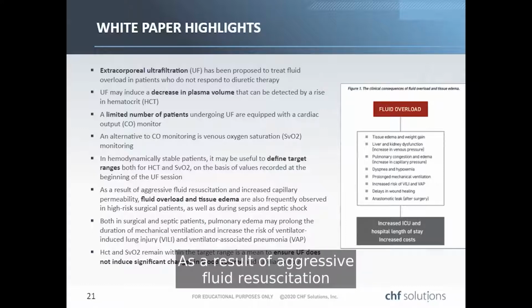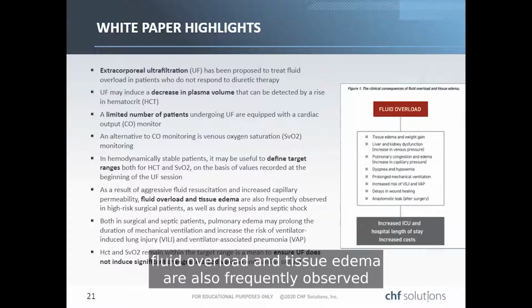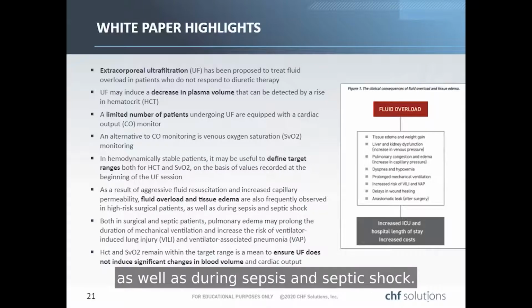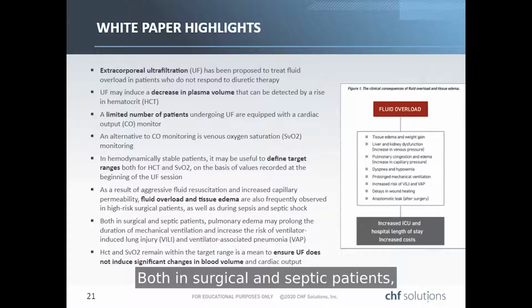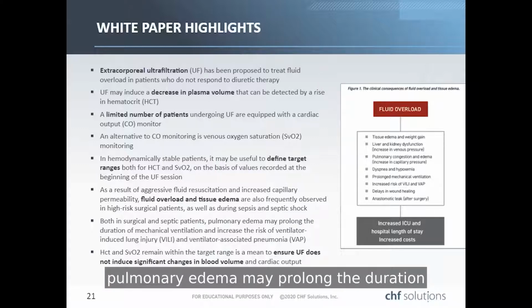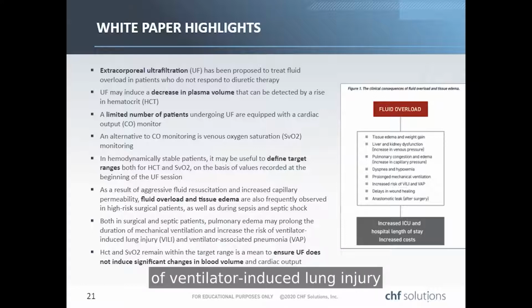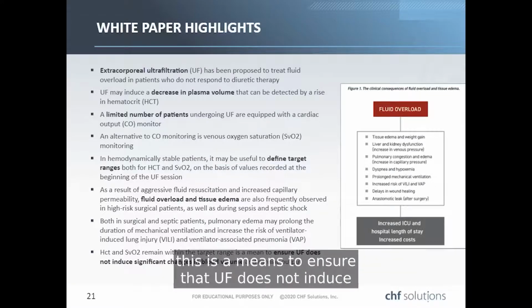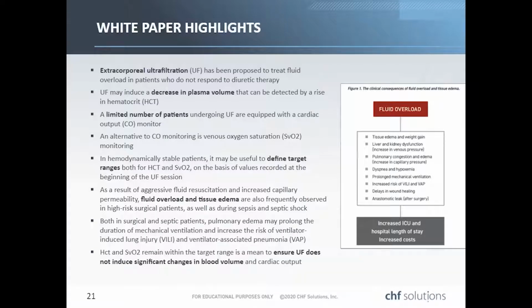As a result of aggressive fluid resuscitation and increased capillary permeability, fluid overload and tissue edema are also frequently observed in high-risk surgical patients, as well as during sepsis and septic shock. Both in surgical and septic patients, pulmonary edema may prolong the duration of mechanical ventilation and increase the risk of ventilator-induced lung injury and ventilator-associated pneumonia. If hematocrit and SvO2 remain within the target range, this is a means to ensure that UF does not induce a significant change in blood volume and cardiac output.